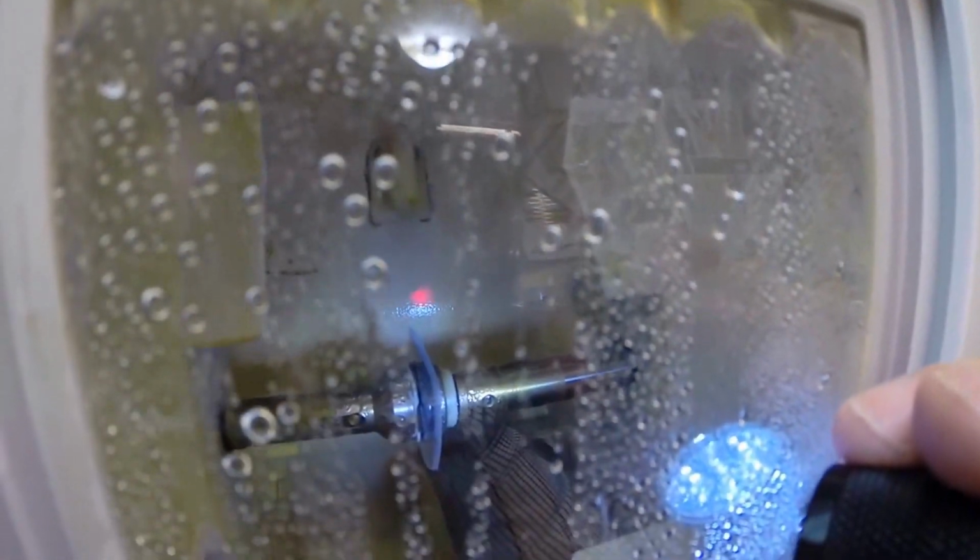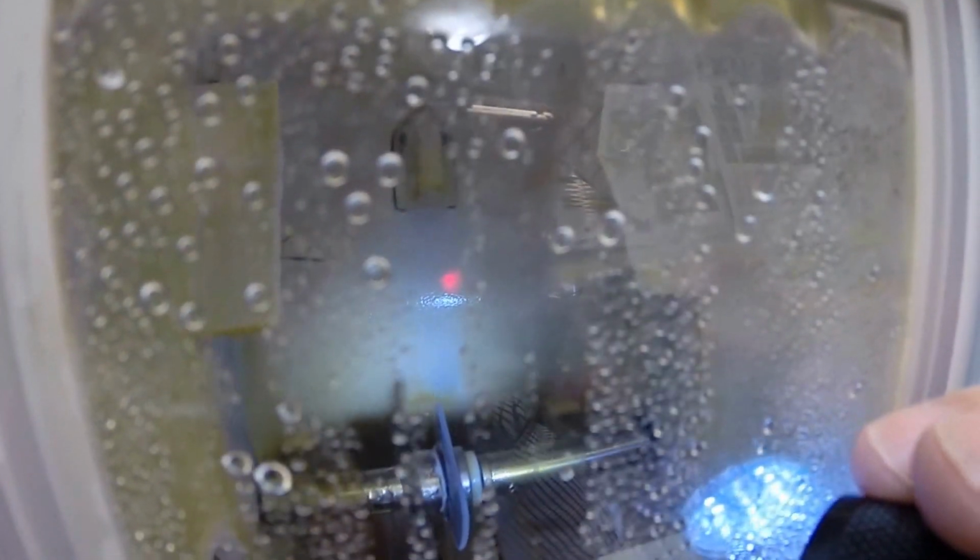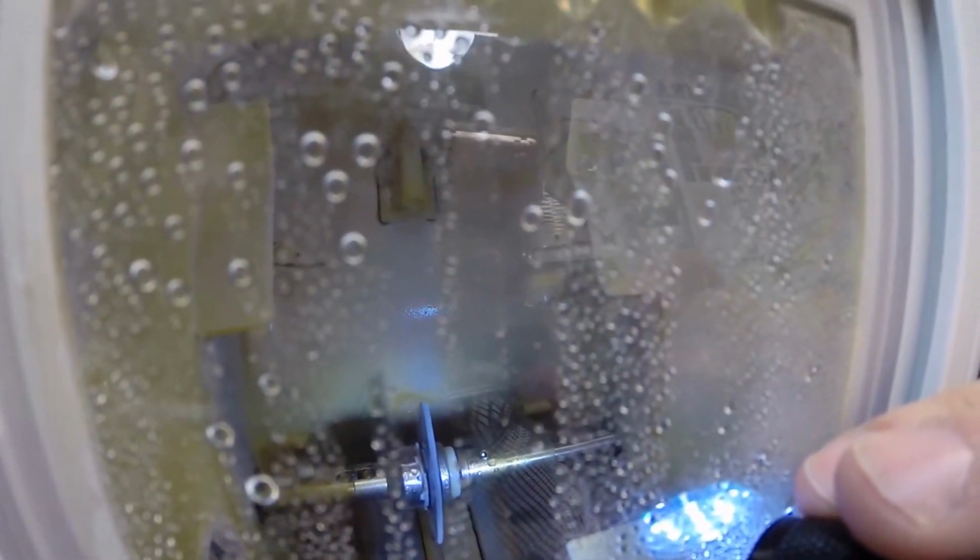Now the lens does not go onto the cutting wheel, it just goes onto the bevel wheel. The old golden rule, you can always cut more off of a lens, you can never add it back on. So I start large and I keep working my way down.